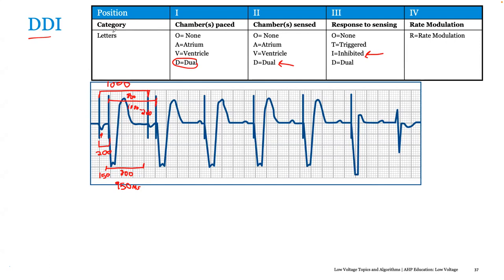SA nodal disease. So in this case, when you put this together, what do you recommend? Because most of our patients for pacing here are usually elderly. Most pacing here is done in people 60, 70, 80, 90, especially around 70. That is the peak time for most of the patients. You can see some, very few, at 40, 50, but most of them, if you look at them, the age range is within that 60, 70. So what do you recommend? What mode do you recommend most times? Because if you review the patient before the procedure, you will decide which pacing mode you are going to give based on the intrinsic activity of that patient.